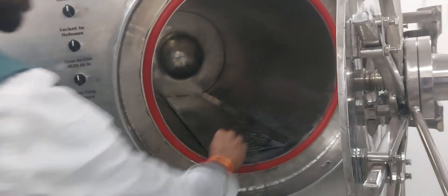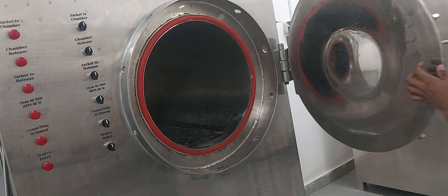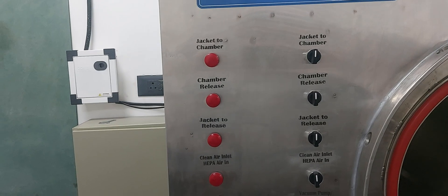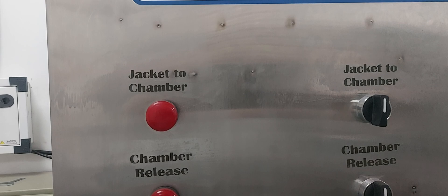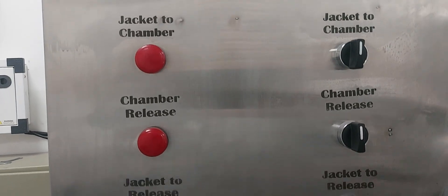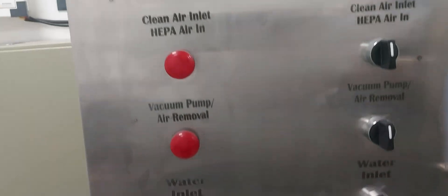These are the trays used in the system, with jacket manual operation. You can also use the indicators for different functions — jacket chamber release, chamber release, jacket release, and clean air with HEPA filters.